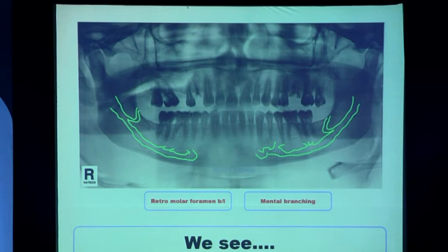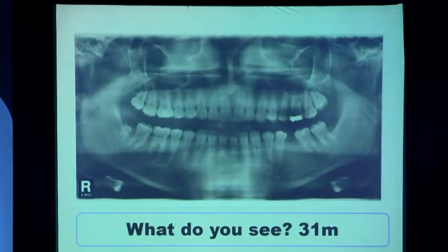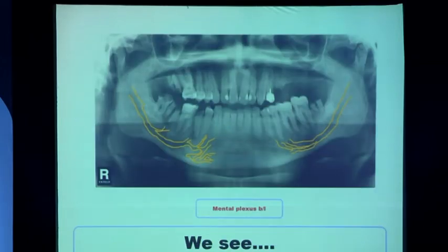You have to think that way, and you have to modify your anesthesia technique so that you give a block better. Again, the modification is you can just give local infiltrations wherever you're working. This is being spoken about here. Unfortunately, because of the time constraints, I could not display all the CBCT images here.